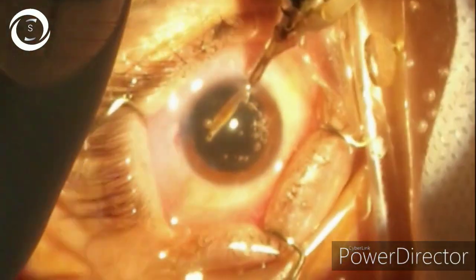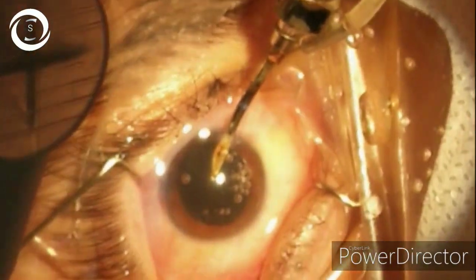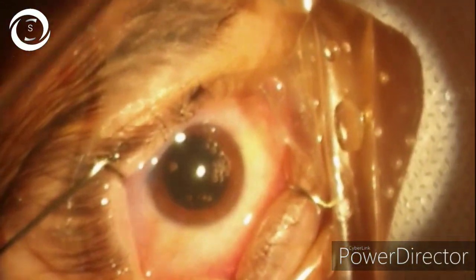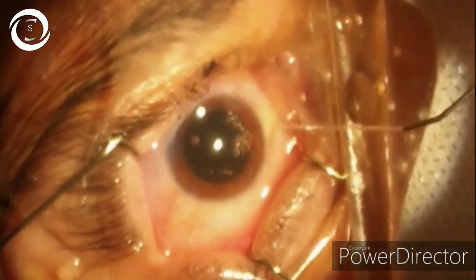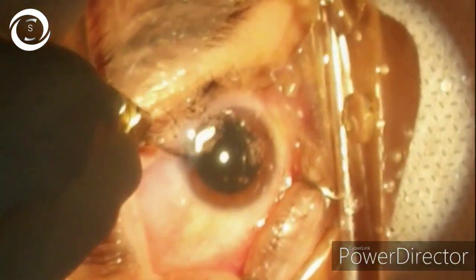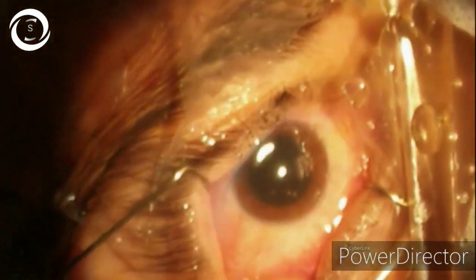You should take care not to cause posterior capsular rupture, because then the chances of retinal detachment become extremely high. You should also very gently aspirate the cortical matter and the nuclear matter because you may damage the zonules as well. Very slowly we are removing the nuclear sheets and the cortical sheets.